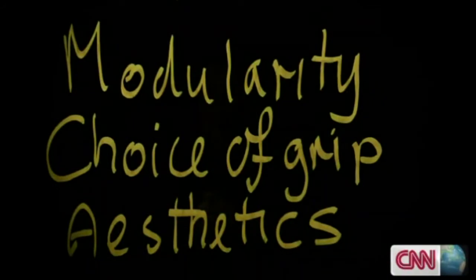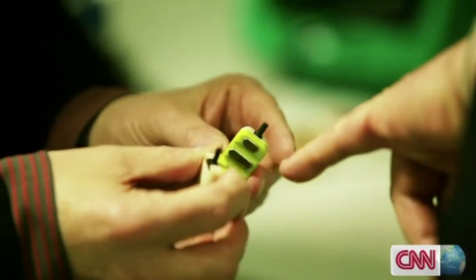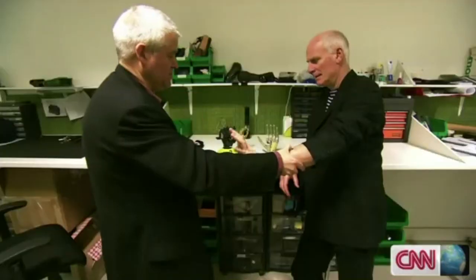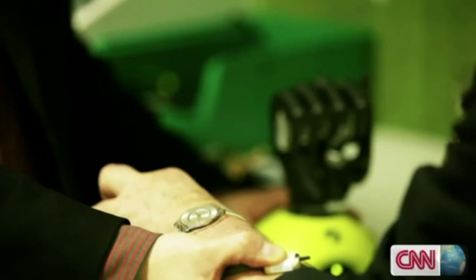We've broken through the barrier of making a hand that has to look like a medical device. How easy are they to operate? Sensors are attached to the muscles on my upper arm, just as they would be to an amputee. Just make exaggerated movements of your wrist. The key is to move through the movement so one muscle gets tight and the other relaxes.